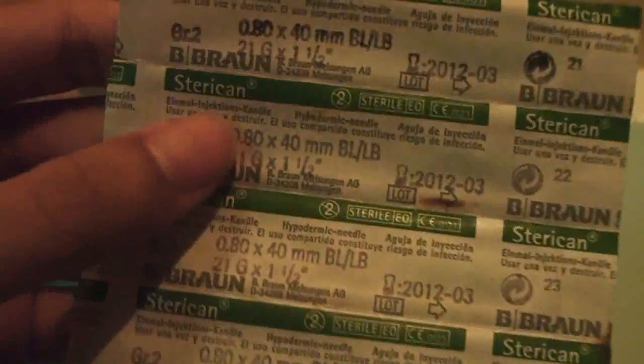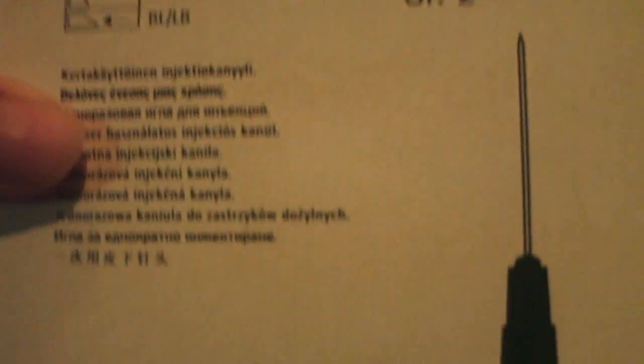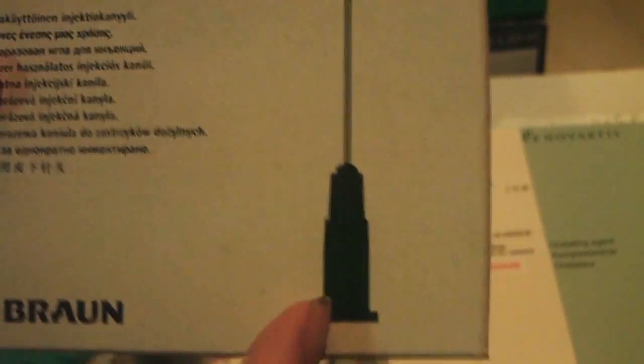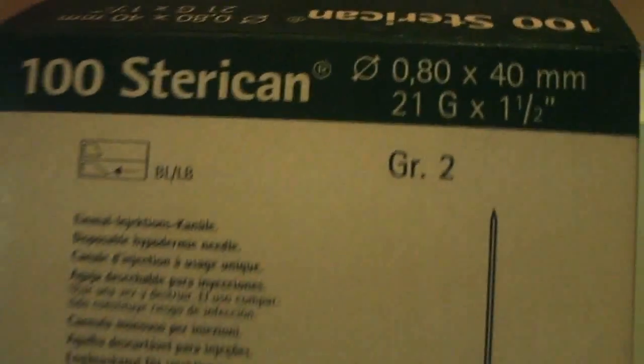Let me show you the needle for the syringe. I don't have the syringe anymore but here's the needle — I still have it. I already gave away the syringe and butterfly needle. Here's the syringe box, it's dusty but I'll show you. The needle you use to withdraw from the water injection — it's 21G, 1.5 inch length.